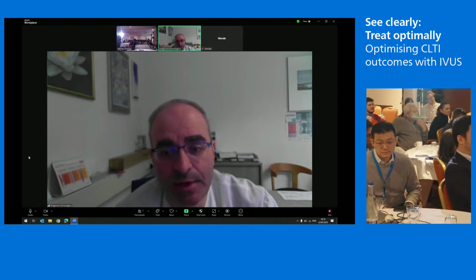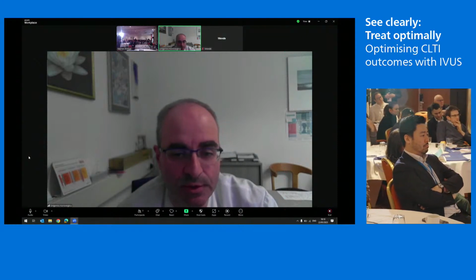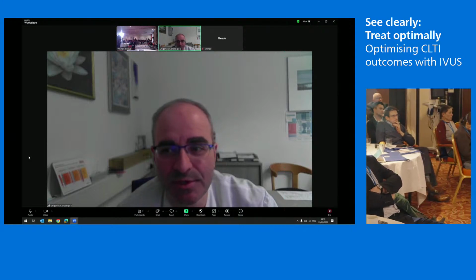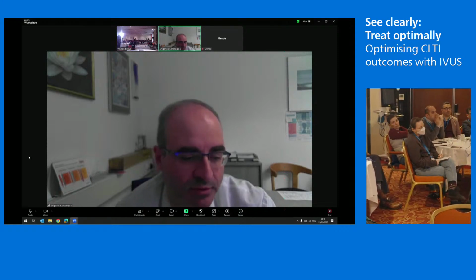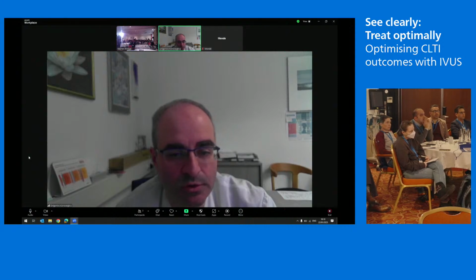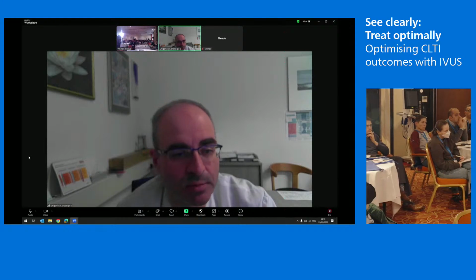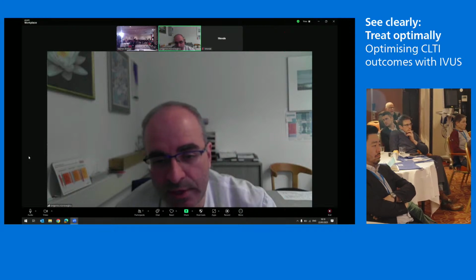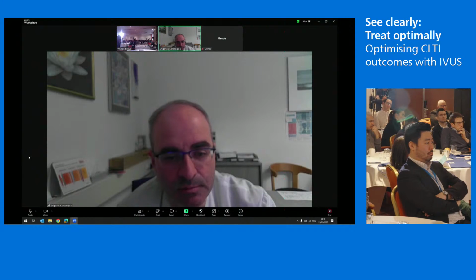Of course, the embolization rate is not 0. You have embolizations. In our registry, it was 2%. So this is perhaps an important message for the group: in case you do atherectomy, independent of the type of atherectomy you're using, you also need to have the tools for addressing such complications. So you need to have a guiding catheter. You can aspirate. We can do catheter aspiration, manual aspiration.